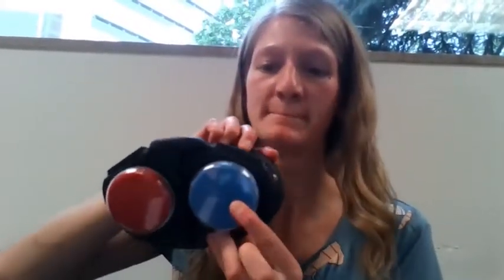I would do the same with the blue button. I would press the red button on the back that says record and the blue button at the same time. And let's say I want to say, I don't need help. I don't need help. And I release at the same time. So then when I press the button, I don't need help. It says that. So this button will say, I need help, and this one, I don't need help.